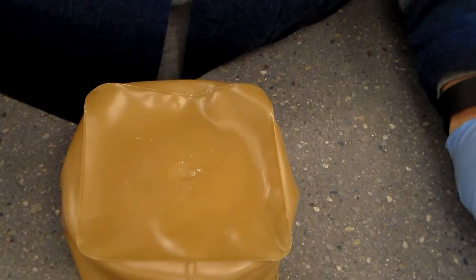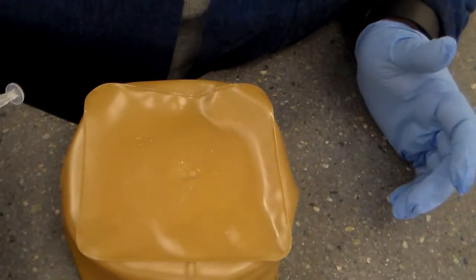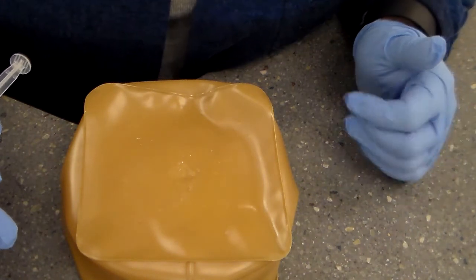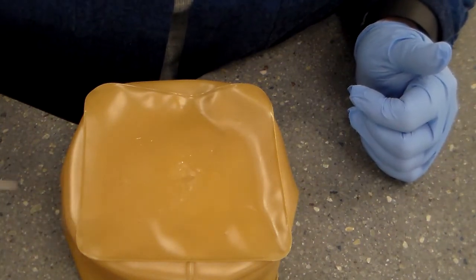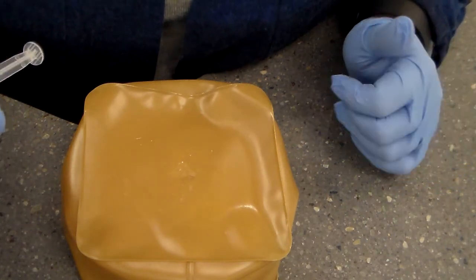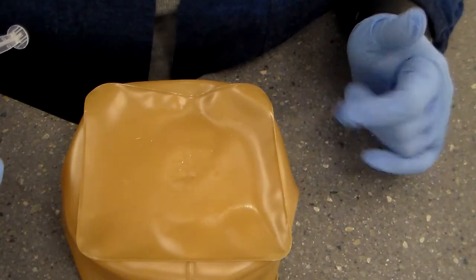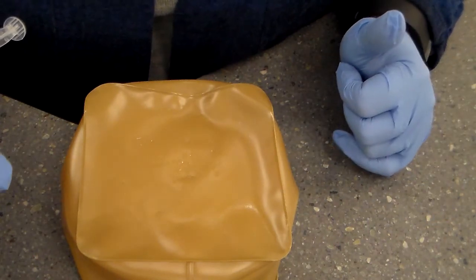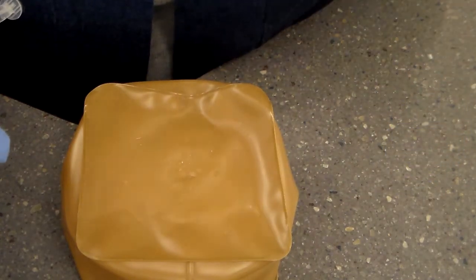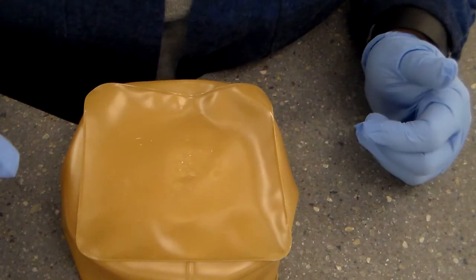We're going to select the injection site, identify bony prominences or landmarks. We're going to consider the client's size, amount, and the viscosity of the medicine being injected. We're also going to alternate sites each time we give an IM injection. So you're not always going to give it in the upper right arm every single time. You're going to move it around so that the muscles aren't getting sore.